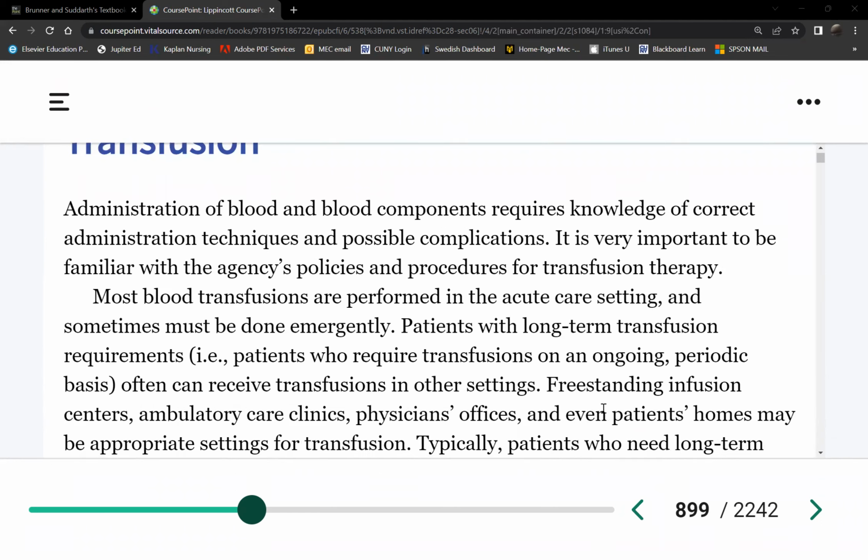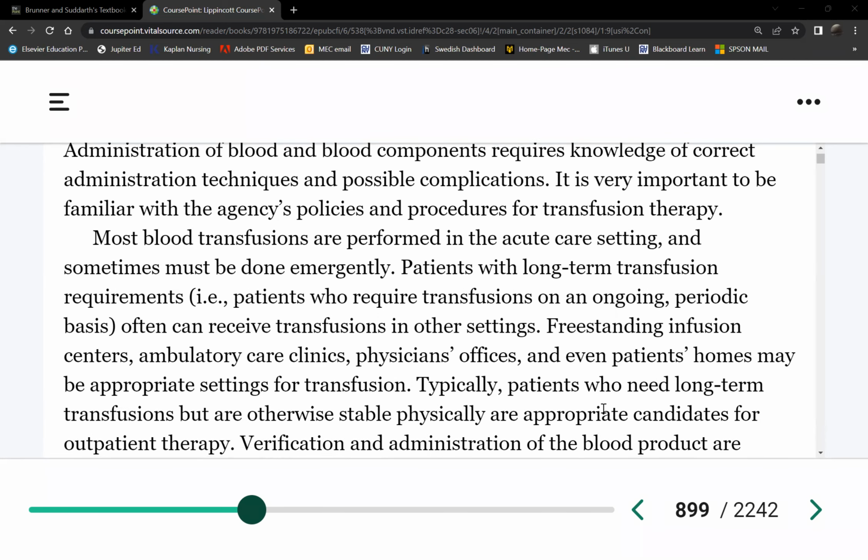Keep in mind that these are still IV solutions. So this involves the same skill you practiced and learned last week with setting up the IV. It'll be the same with a few differences in the detail because we have a different tubing. But since it's still an IV tubing, the principles will be the same.